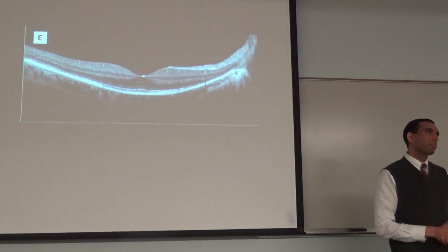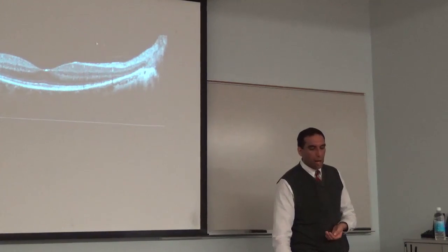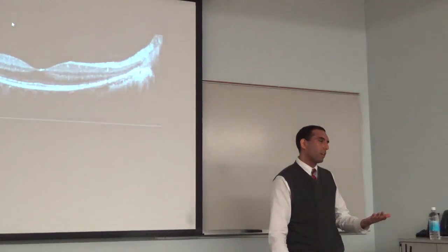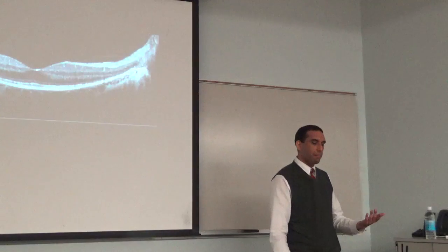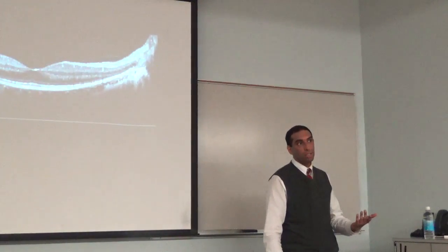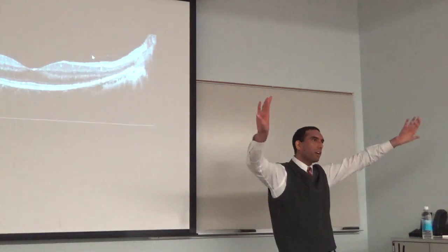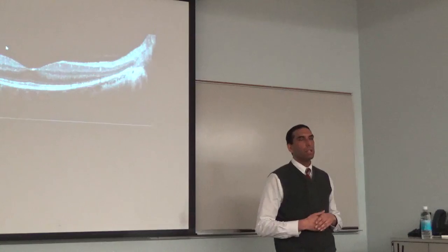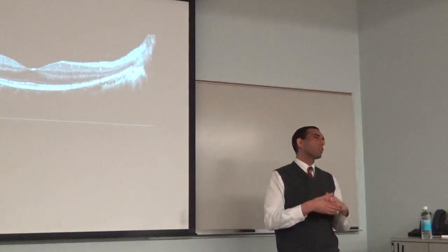And are you getting a full image of the eye with that, or is that just... We can get, with the common cameras and lenses that we have, the devices that we have commercially available, at most about an 8 millimeter cross section. We can't get the entire back half. So that's not cropped? That's like a typical image. This is not cropped. Absolutely not. You can get a montage. You can take a couple of OCTs and put them together, but it's usually not useful.